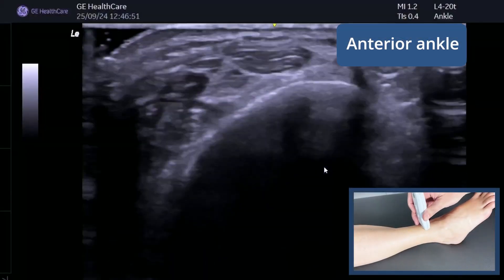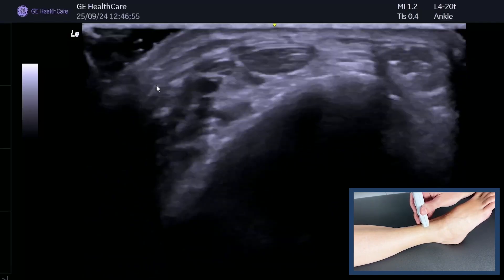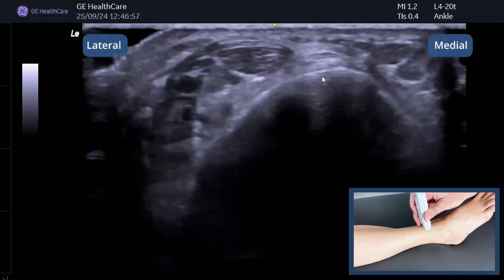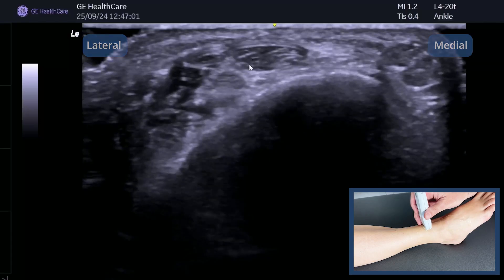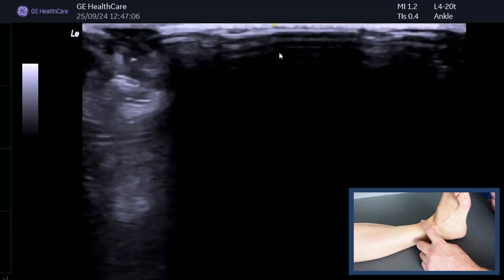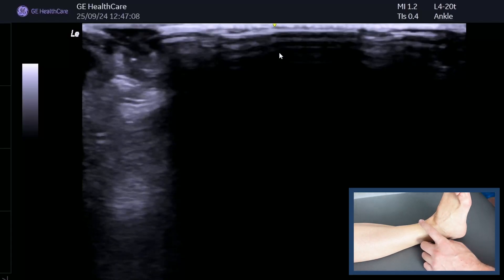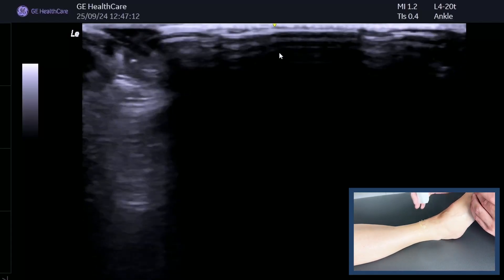Now we're going to look at the anterior ankle. This is the lateral aspect of the screen and this is the medial aspect. The best way of finding the tendon of tibialis anterior if you can't find it straight away is to get the patient to flex their foot up — you see that lovely big, nice solid tendon there is tibialis anterior. We then relax the foot down.